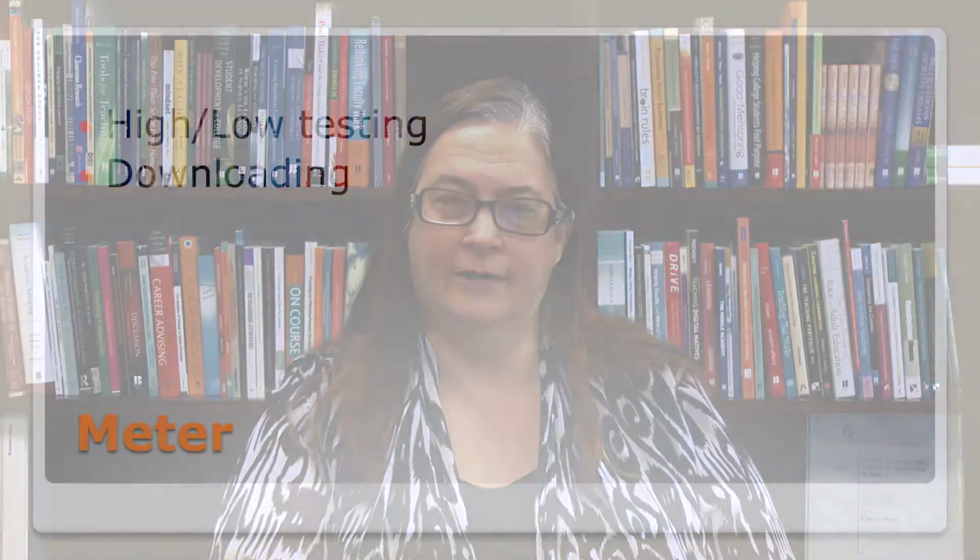After you get the blood sample, you're going to have to dock your meter in order for it to upload into the system if you're at a hospital and it's being downloaded into the EMR. Some of it will go directly on, but if you don't download it every now and again, it's not going to recharge and it's not going to complete downloading the rest of the information.